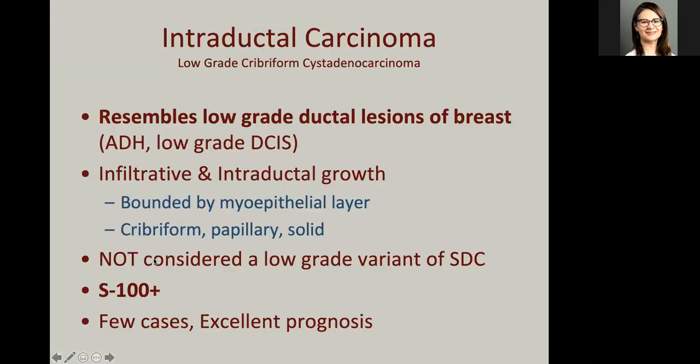Okay, there is another carcinoma called intraductal carcinoma that, again, to a pathologist sort of resembles a low-grade DCIS or a low-grade atypical ductal hyperplasia of breast.